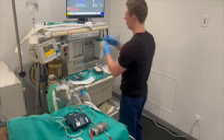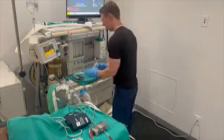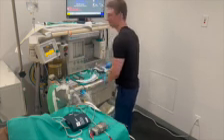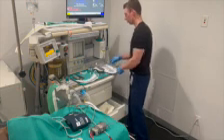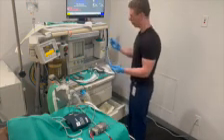In addition to the primary airway, it is also prudent to have an appropriately sized LMA close by. The LMA has proven to be a valuable part within the difficult airway algorithm and can be a life-saving measure in a can't intubate, can't ventilate scenario. Lastly, make sure that you have a bougie available for those situations with anterior airways that cannot be visualized with the standard direct laryngoscopy approach.